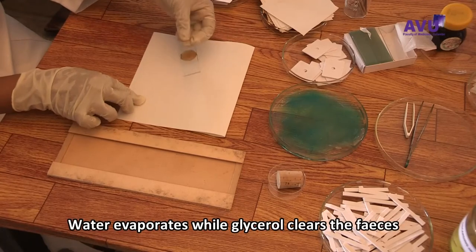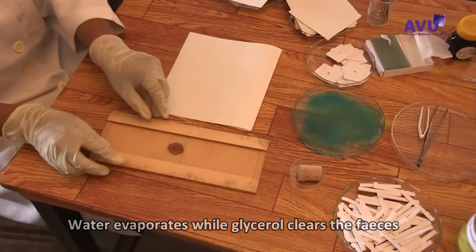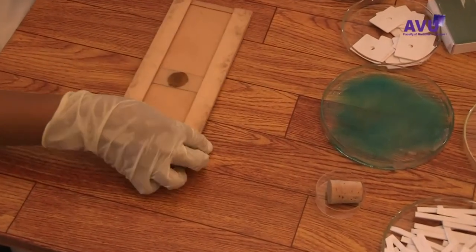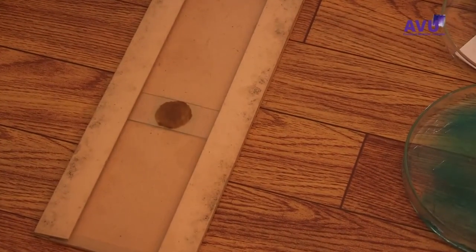Place the slide on the bench with the cellophane facing upwards. Leave for 30 minutes for the faecal material to clear. Note that hookworm eggs clear rapidly and will no longer be visible after 30 to 60 minutes.